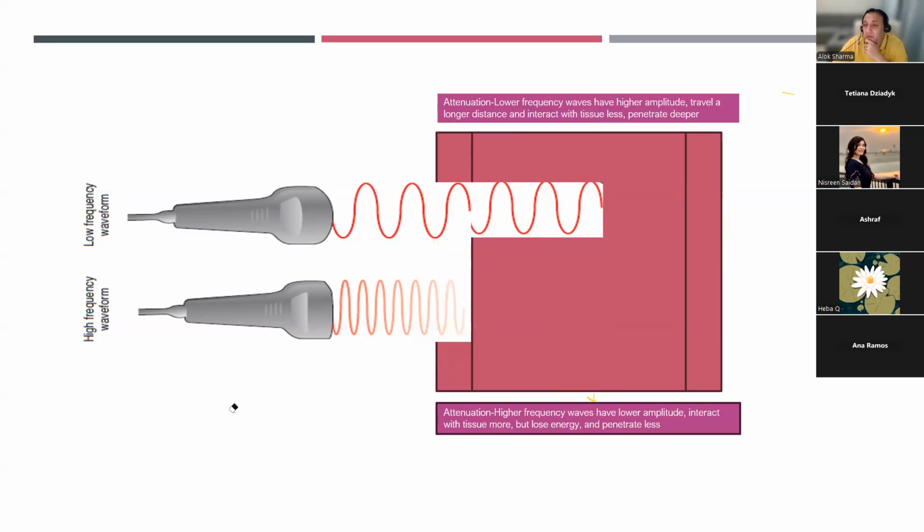So, if I'm using a 400-gram baby, a probe with a frequency of 15 to 16, which is technically the hockey stick, which has a smaller footprint, would be much better as compared to using a linear probe, which may have a lower frequency. But in adults, for example, they tend to use the curvilinear probes, with frequencies of 5 to 6, because naturally their lungs are much bigger and you really have to penetrate up to 10 centimeters in an adult. In a term baby for us, 4, maybe 5 max. In preterm babies, we normally say 2.5 to 3. Smaller the baby, you can go down to 2.5 centimeters.